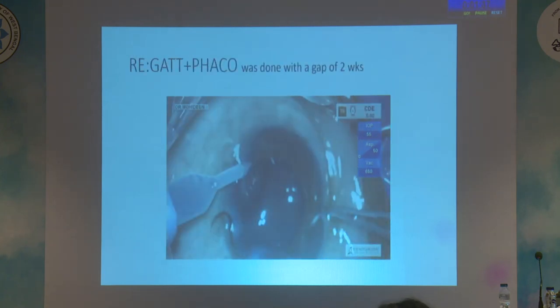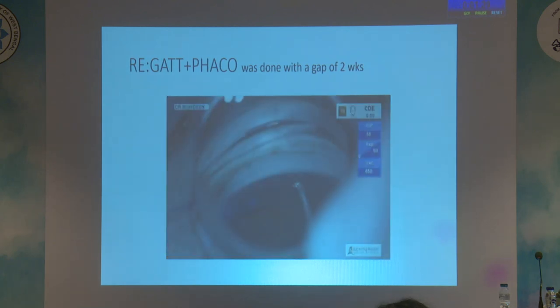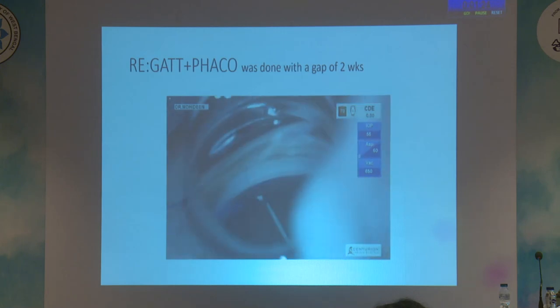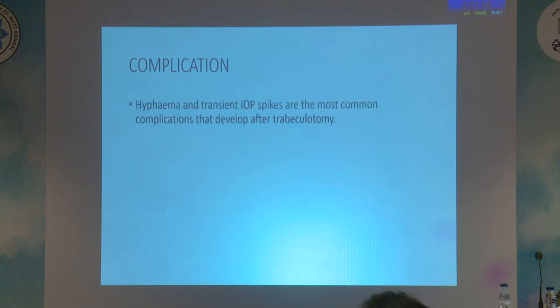The same patient underwent GATT with phacoemulsification within a gap of 2 weeks. The microscope tilt and the patient positioning is one of the key factors for a successful GATT. Postoperatively, the intraocular pressure was well controlled in both eyes without any complication in the patient.